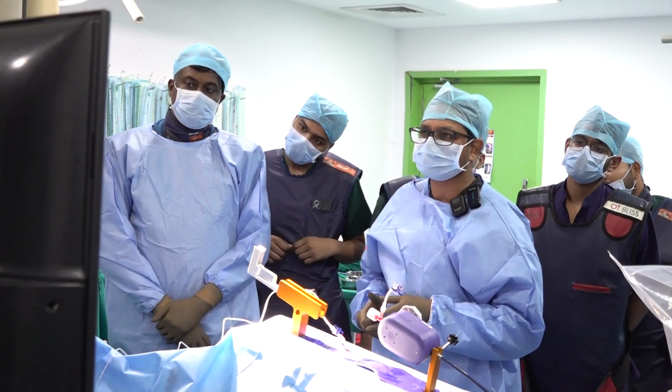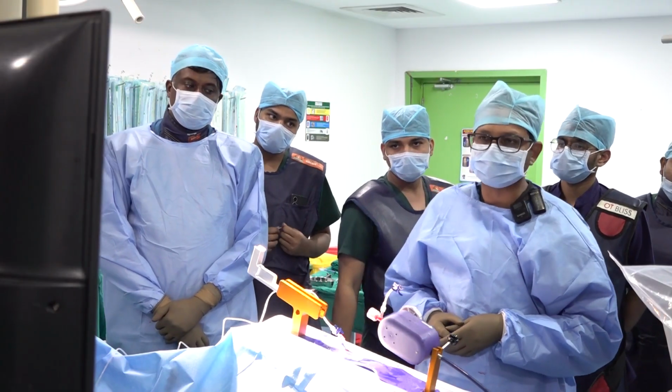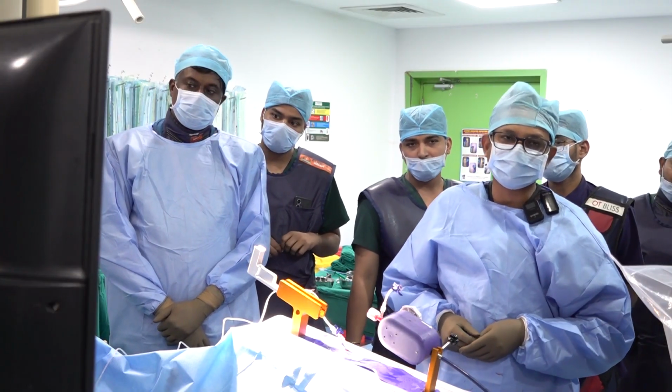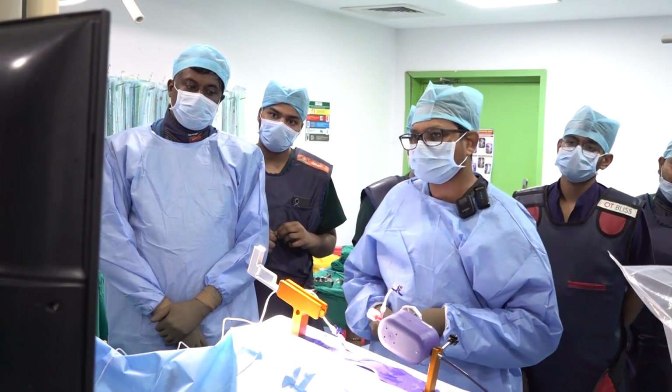Parameters are good, pressures are good. We don't need any vasopressor support for this patient, and we are just giving him some dobutamine just to facilitate the LV. So I think we have successfully done the MyClip case.